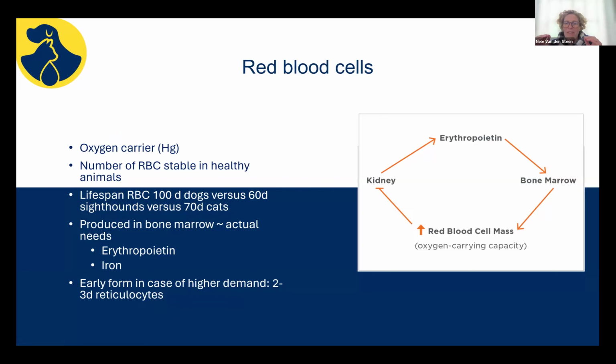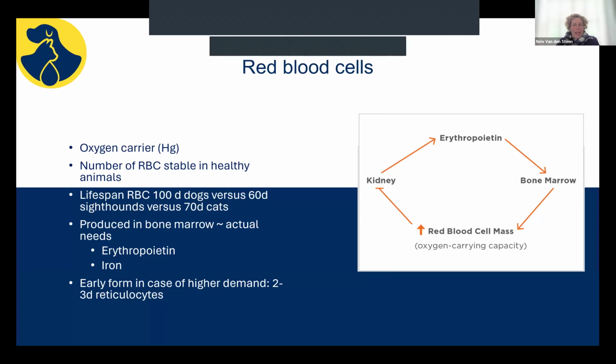Obviously, be careful to compare it with a blood sample that was taken in a diseased patient anyway. But if you've got a baseline for that patient, that might help you to compare it with.